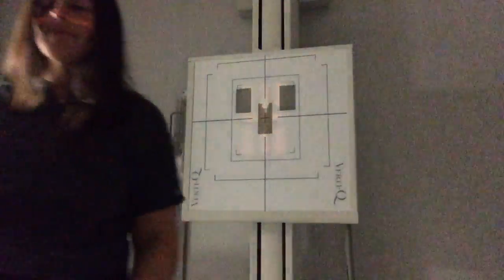Now we're going to adjust the camera a little bit so we can demonstrate the cross table C-spine. It's going to be done with the patient laying supine on the table.